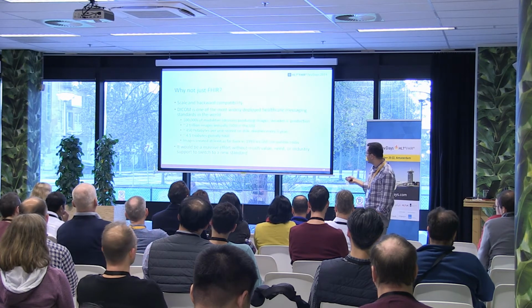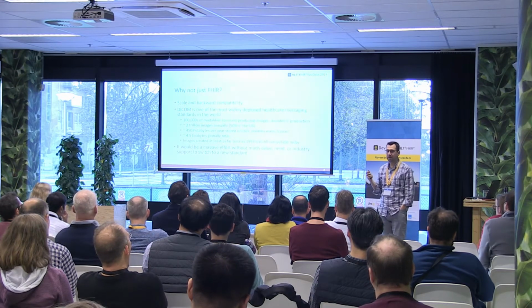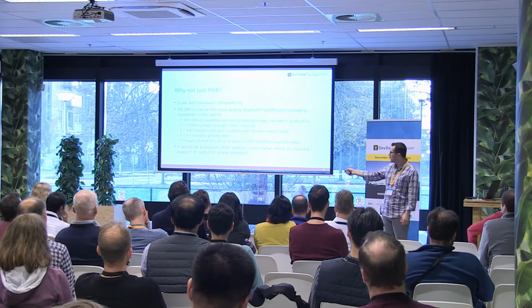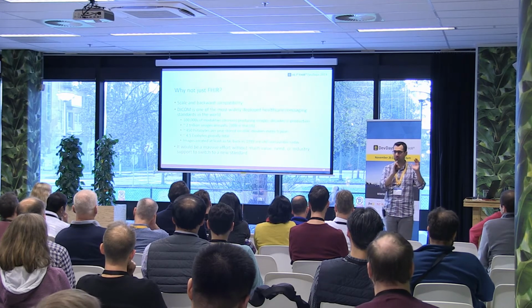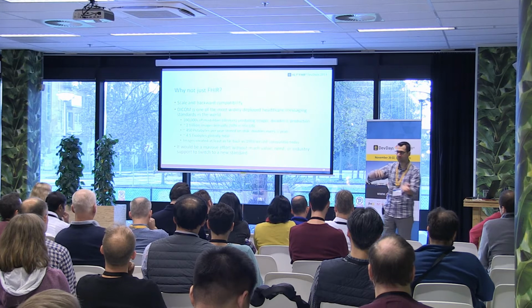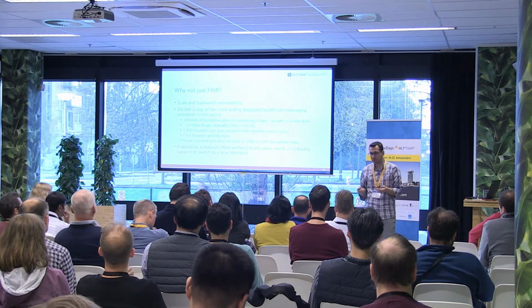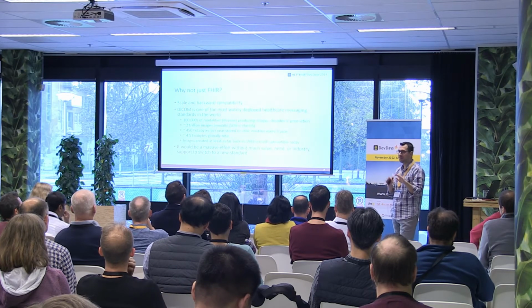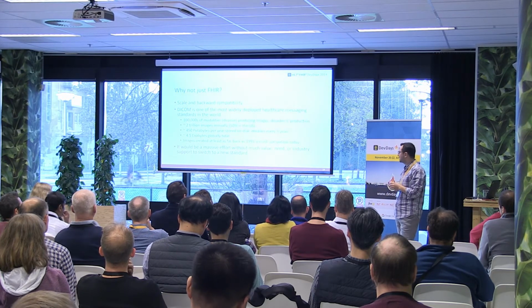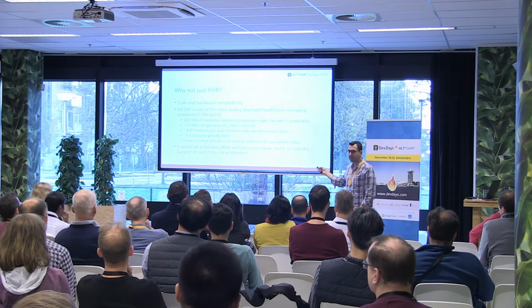And of course, the other one is having backwards compatibility here is very important because to run through that much data and translate it from something like HL7 V2 to FHIR would be a massive task that nobody in their right mind would actually want to go through. So better leave it for DICOM. DICOM is meant to handle these things. Any questions about this before I move on? I hope it makes sense.